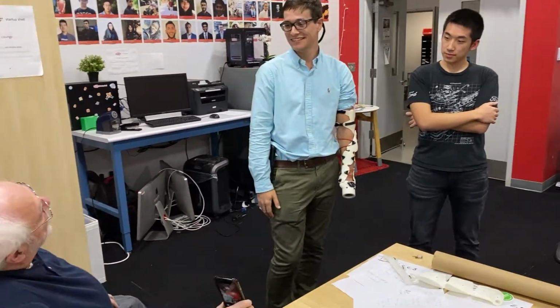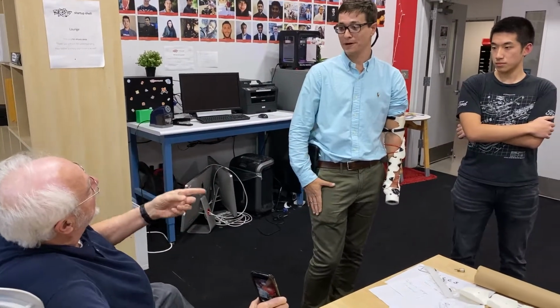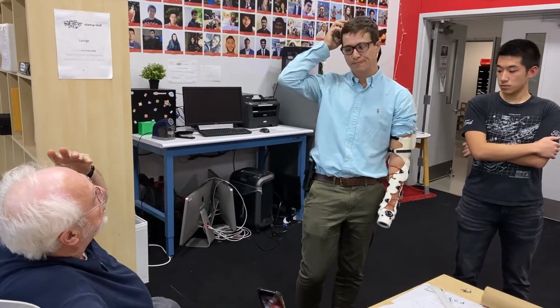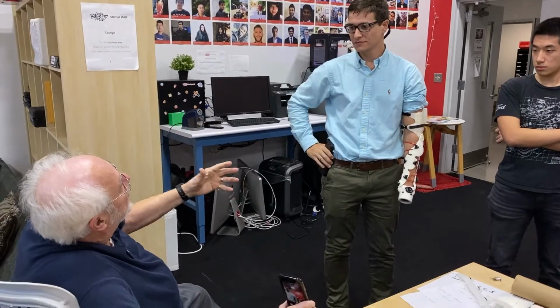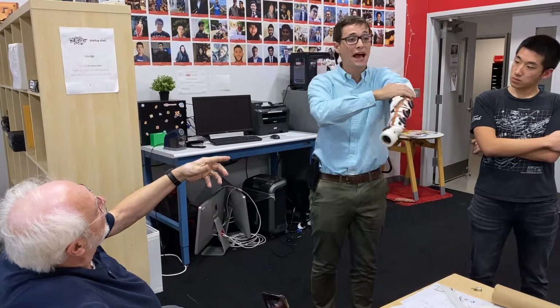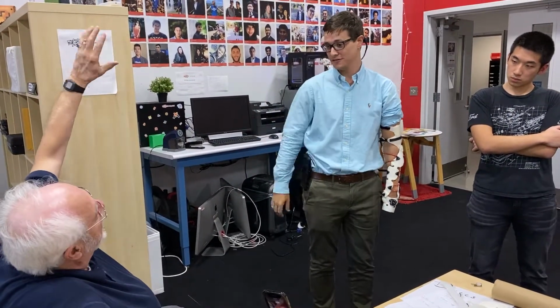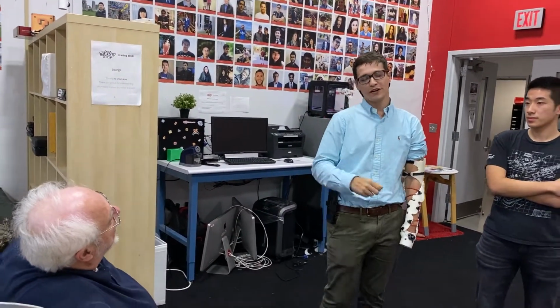Now, I'm interested. You remember from last year we had the FDA guy give us a talk, Matthew DePrima? You get the class 1 exemption if you use only one degree of motorized freedom. Motorized, that's the key word. So this is a passive socket, so you get all the degrees of freedom. Doesn't the bionic hand have more than one motor in it? They have up to 27 degrees of freedom, but if they only use one at a time, we can ask more than one at a time, right.